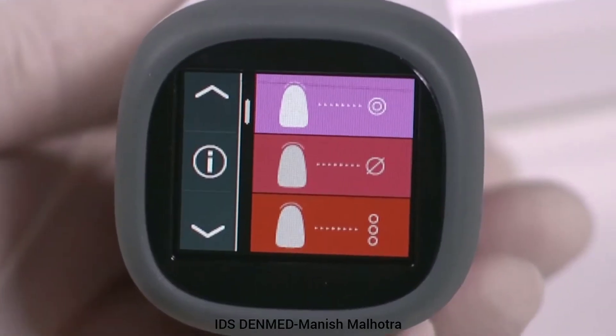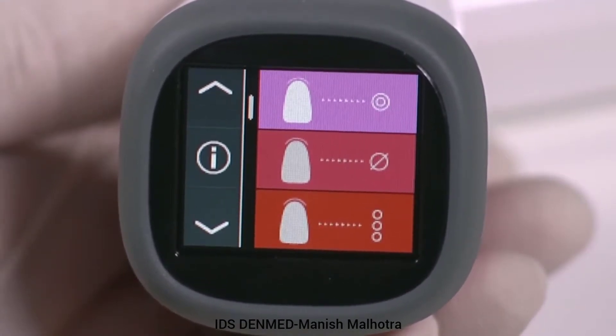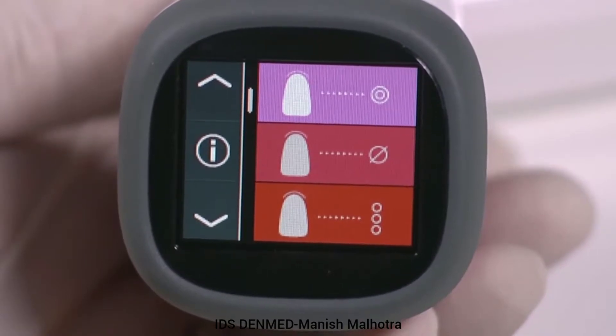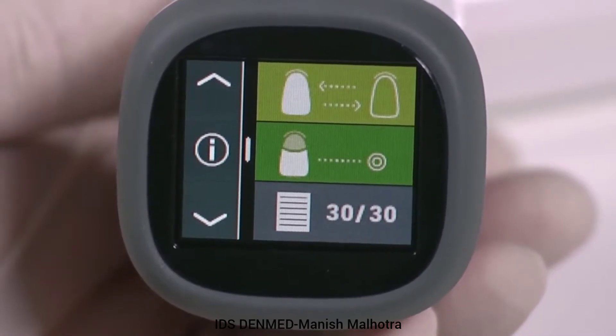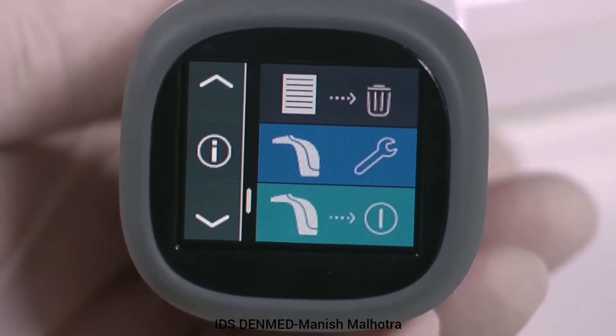There are three main screens available to navigate through by touching the up/down arrows. The first screen is for measuring natural teeth. The second screen is for measuring ceramic restorations and for memory review. The third screen is memory delete, tools, and the off button.